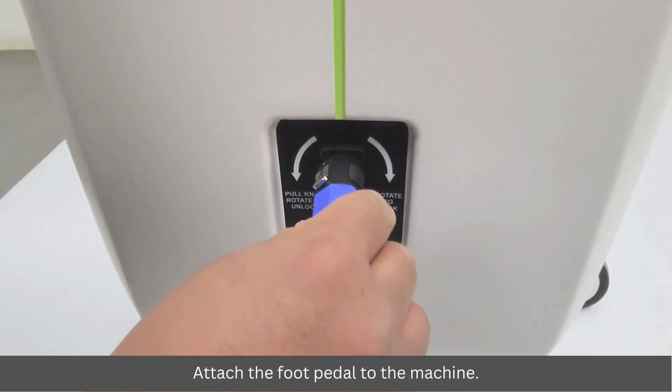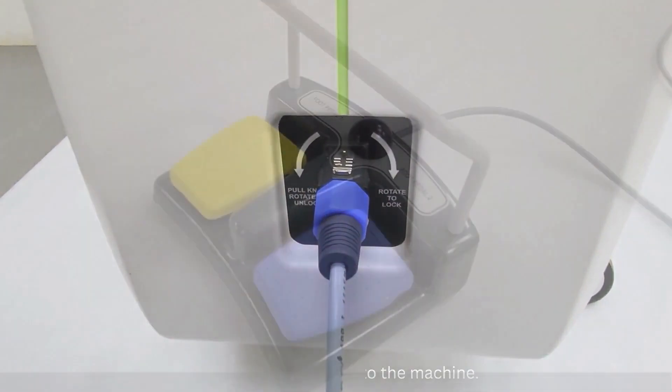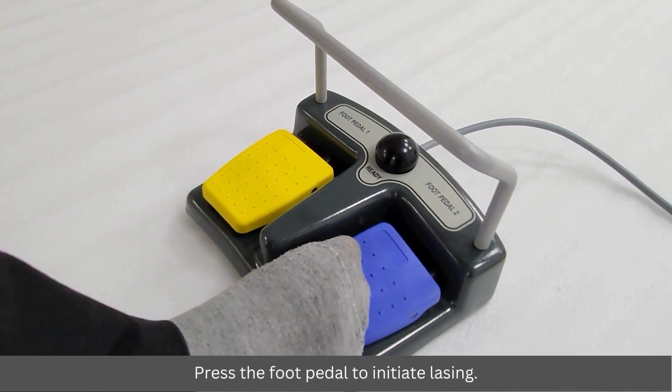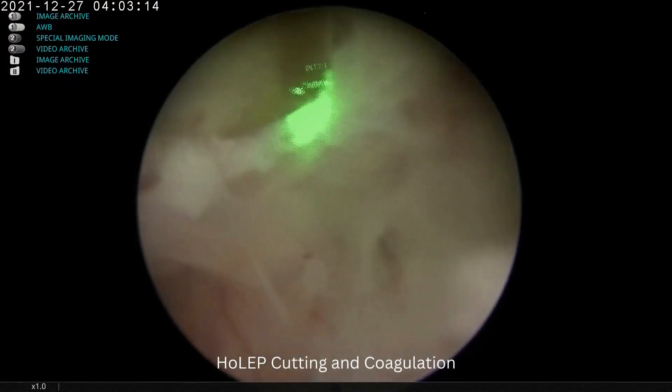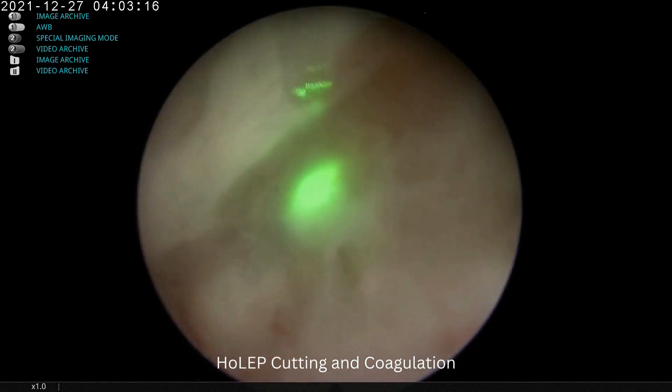Attach the foot pedal to the machine and press the foot pedal to initiate lasing. Applications include tissue cutting and coagulation.